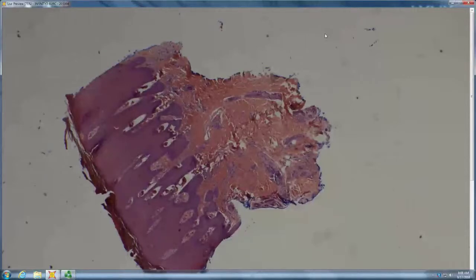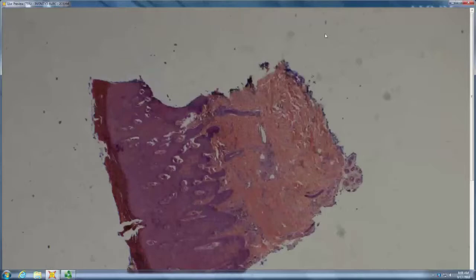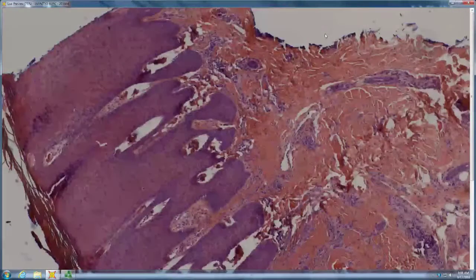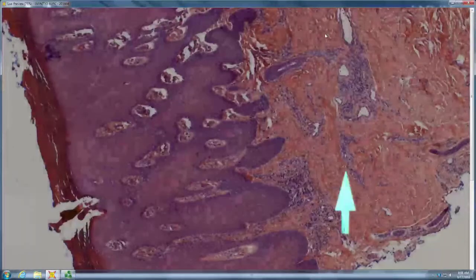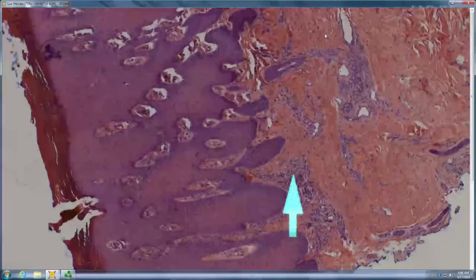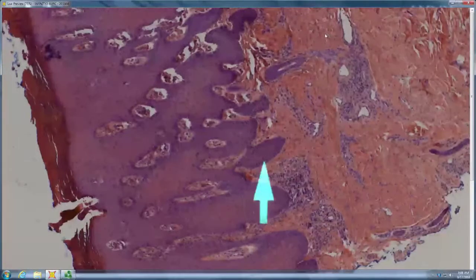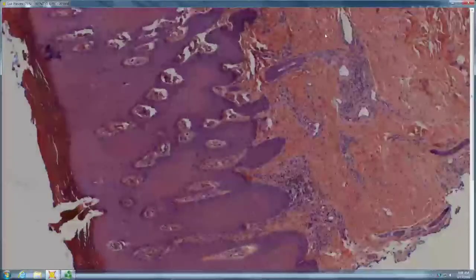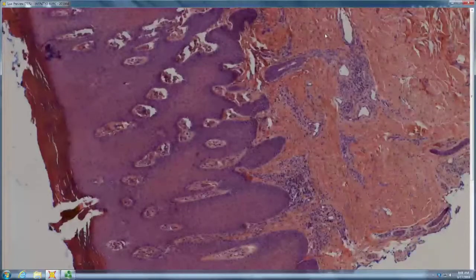It looks like acral skin. Acral skin, scar, parakeratosis. And what if it's not acral skin? You have lots of fibrosis, lots of vessels, lots of thickening. Prurigo. Yeah, it may just be prurigo or lichen simplex, where it looks almost like lichen sclerosus, but it's not.